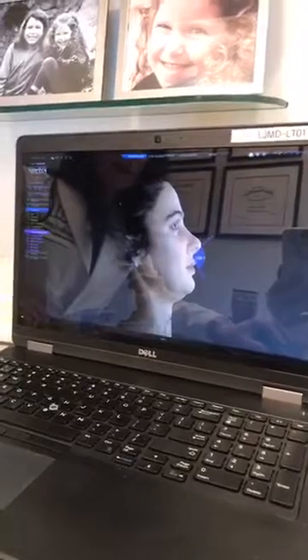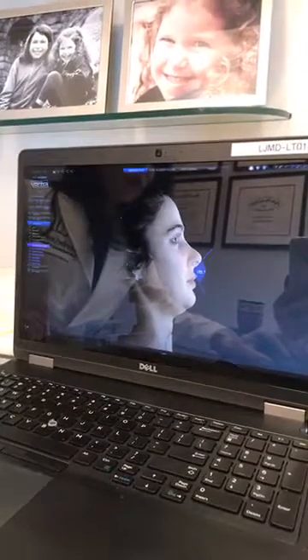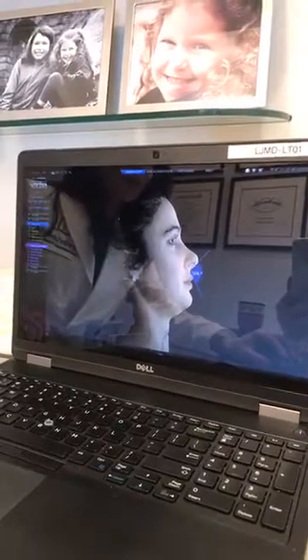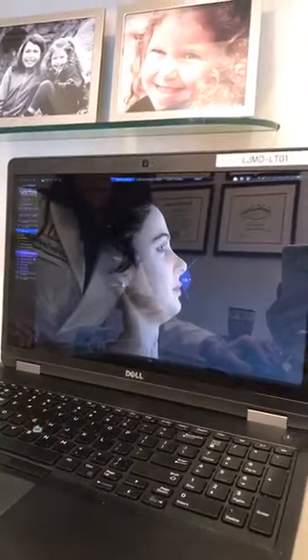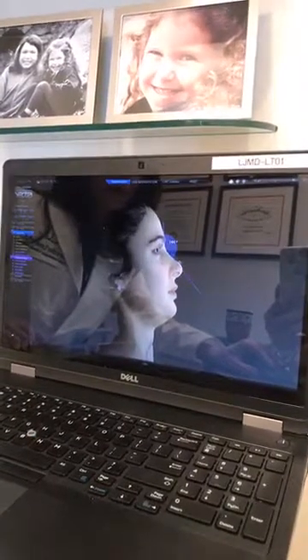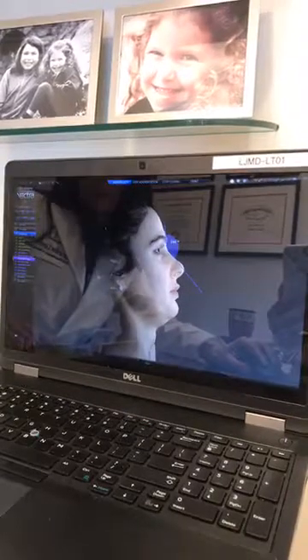Then if we look at this angle here, this tells us how rotated the tip is. Depending on whether it's a man or a woman, this could be anywhere between 95 and 115 degrees, and we see that Kristen is just right for women at 106 degrees. Again, her nasofrontal angle is a little bit more than it should be because she has a little bit of a dip right here, but it's still just fine.